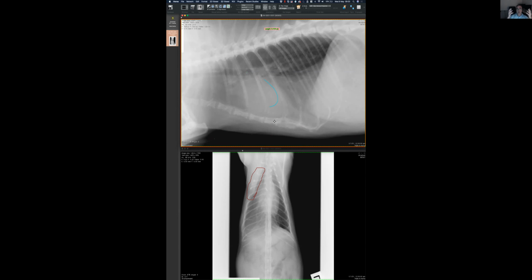So if there is more opacity, there is going to be somehow more tissue somewhere. Where is it? I think in this case it looks like an alveolar pattern to me, because I'm not seeing any of the vessels or anything running through.